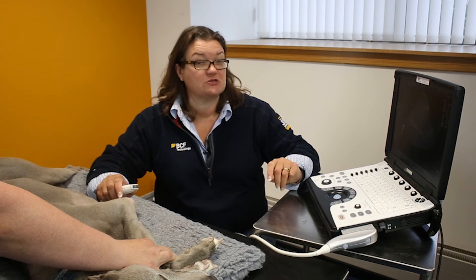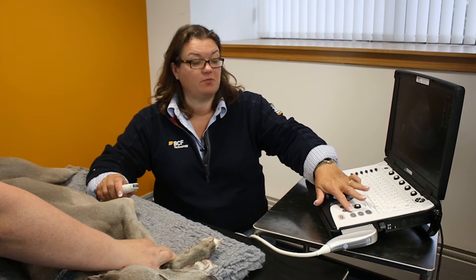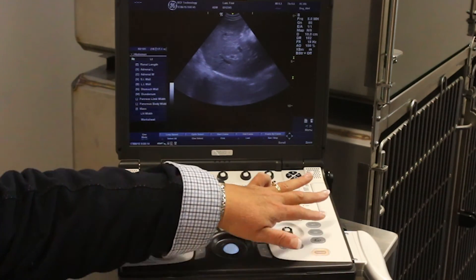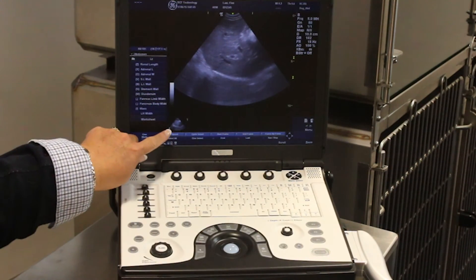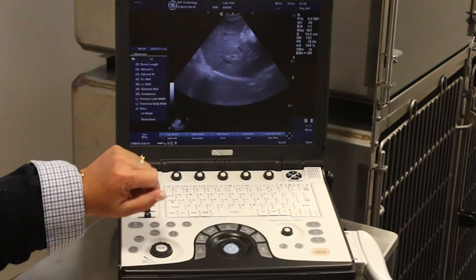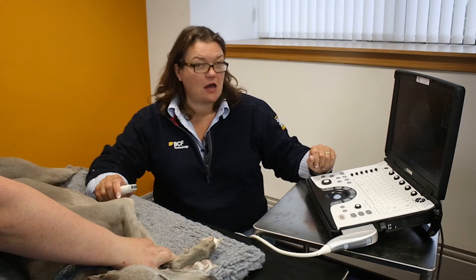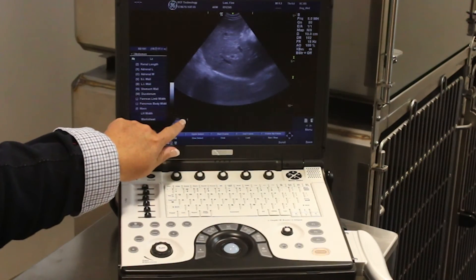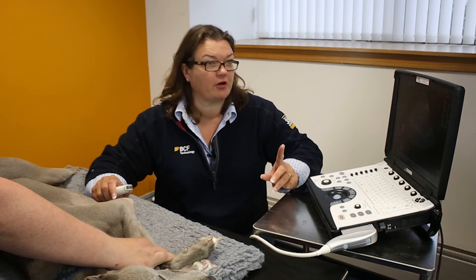When you have the image on the screen that you want to save, P1 — which is a programmable button programmed to be our save and store key — will save the image as a thumbnail at the bottom. You'll be able to tell that you've saved a still rather than a cine at this point because there's a number one in the corner, which indicates that you've saved one frame.